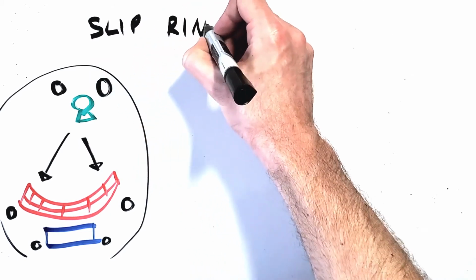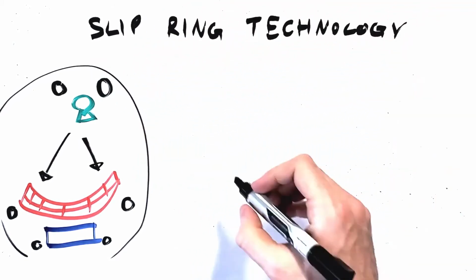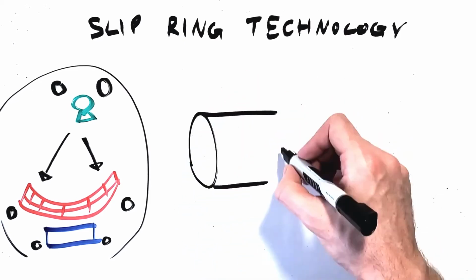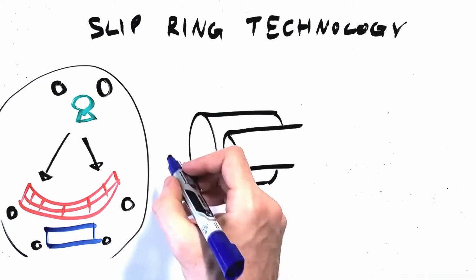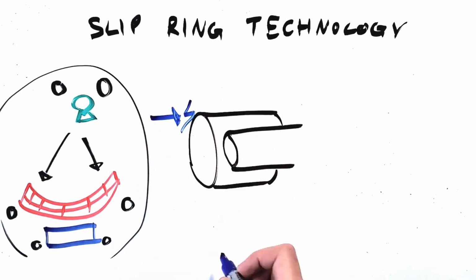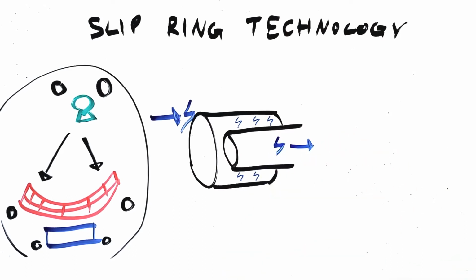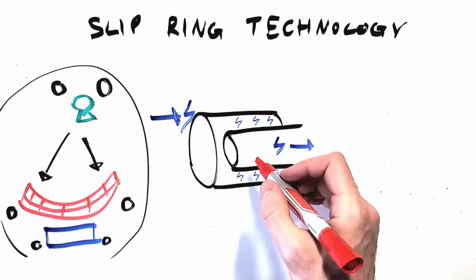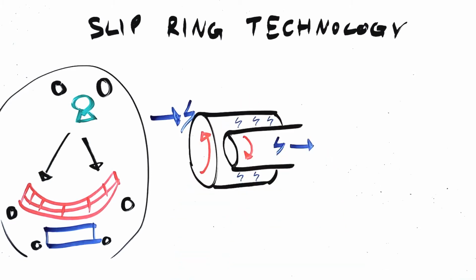Slip rings are used in many modern electronics requiring rotating parts through which an electrical current or signal needs to pass. They function like a bearing where two separate components can turn relative to one another, or one can turn while one stays stationary. But while turning, there is a contact surface, either a smooth ring or metal brushes, which maintains conduction of electrical current or signal throughout the rotation without the need for wires, which would twist up under that type of motion.